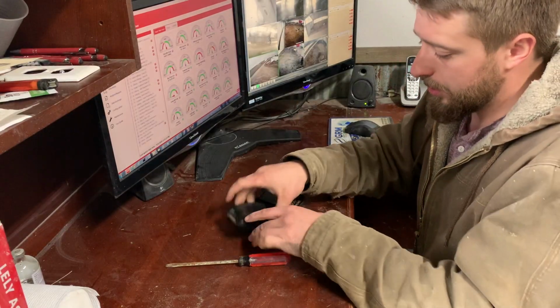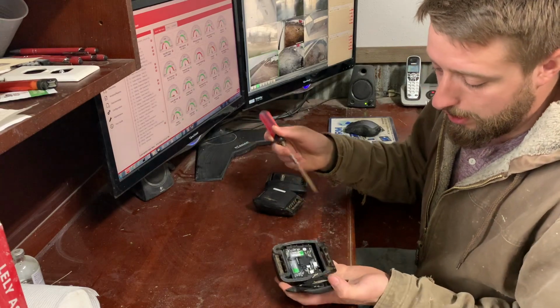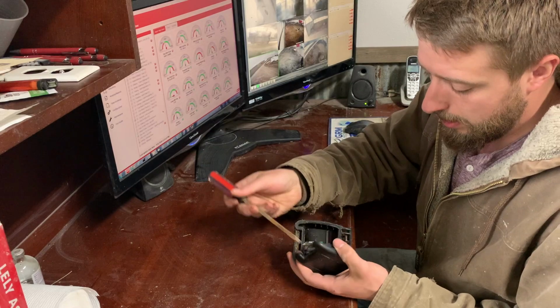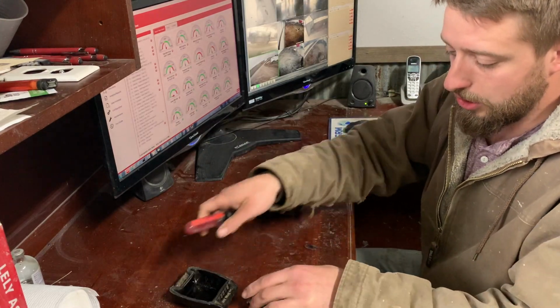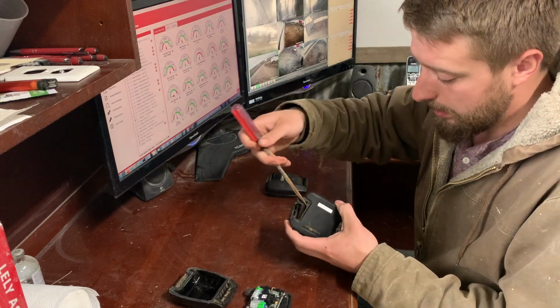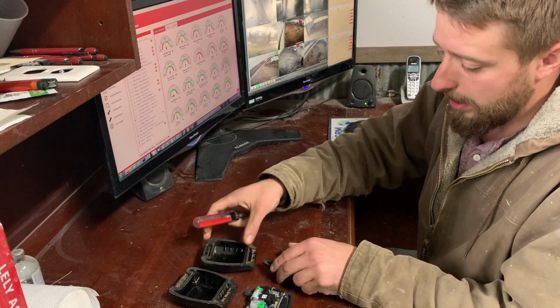Okay, next step is to open the collars up. I usually like to have a flat screwdriver, hold it open with one hand and then just reach in and pop them open like that. And I just like to lay them in order. I usually like to do a dozen or so. It's more efficient to do a couple at a time. That way you have a system.